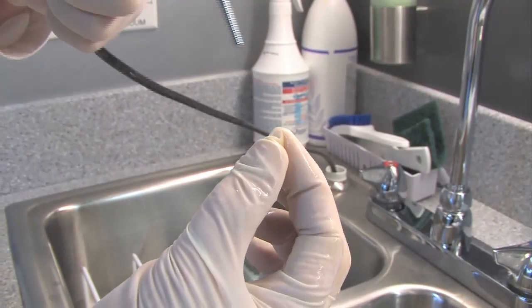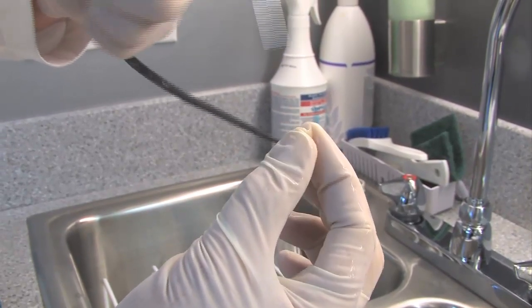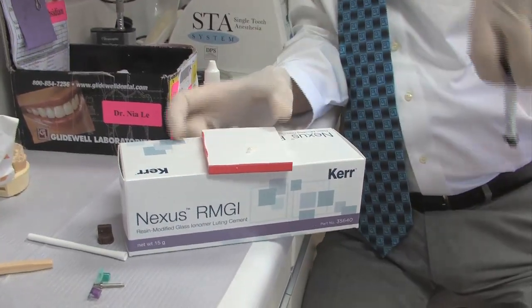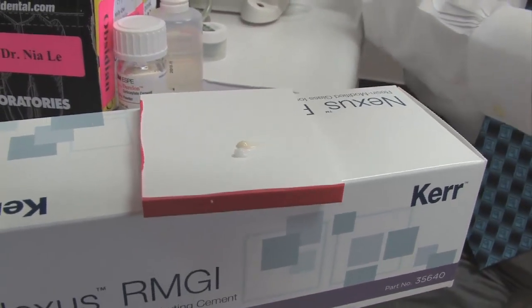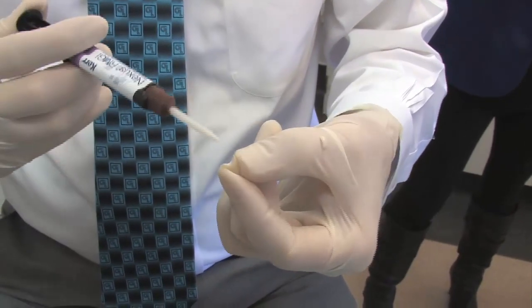Now we're going to put a zirconia primer on the inside of this crown. We've placed the zirconia primer and we're going to hit it with some air. That's going to help the resin in our Nexus RMGI bond to the crown. We bleed a little bit out of the tip — it's an auto-mix system, so as a result it doesn't get much easier to mix cement.